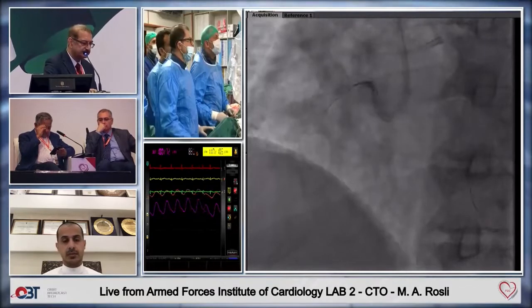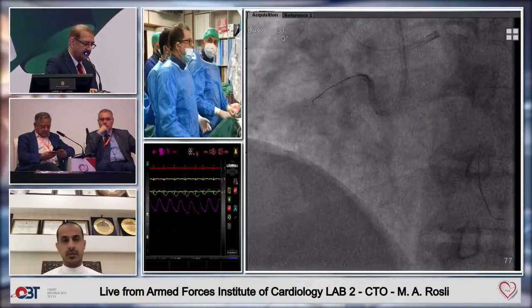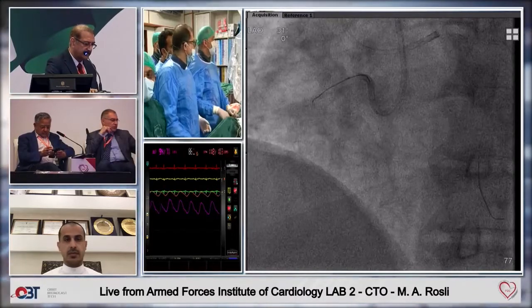Which wire are you using? This is Pilot. Okay, Pilot 50. Can I go to right, please? RAO.